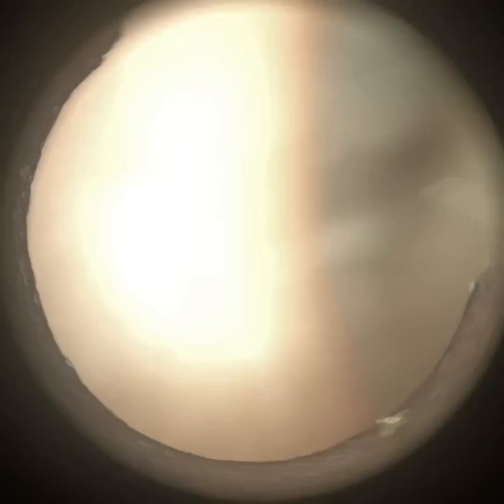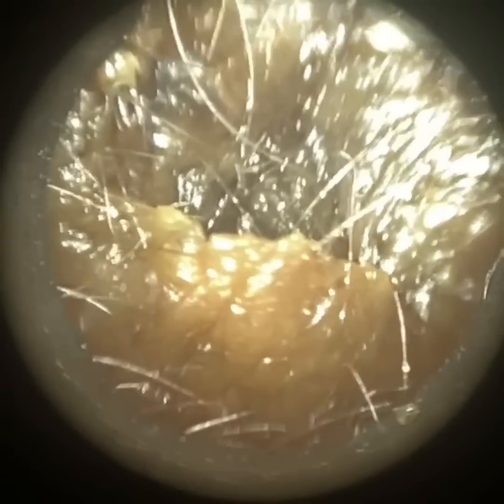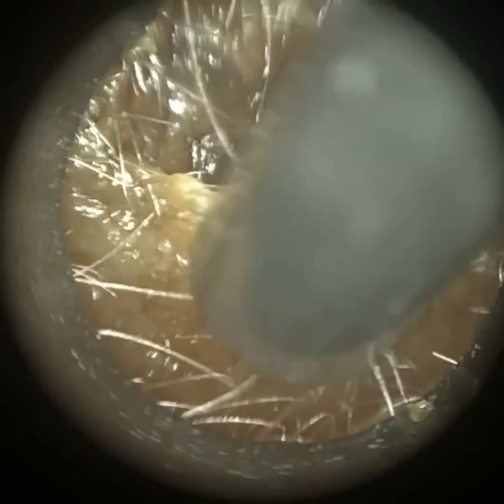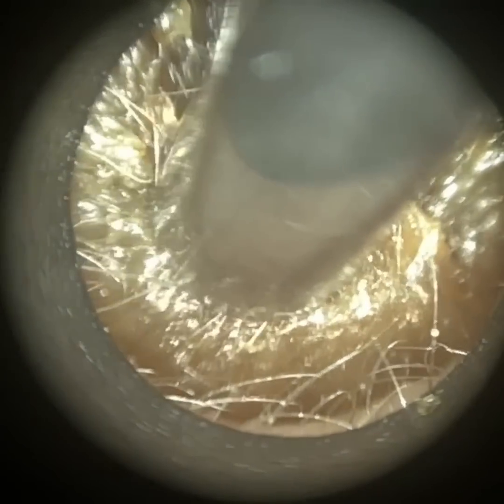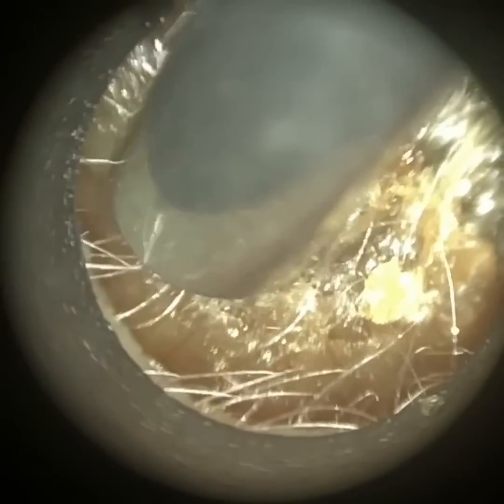And here we have a patient who attended with plugs of dead skin and ribbons of dead skin that I peeled away from their ear canal. And we are treating this patient right here. This occlusion extends right from the entrance where we are now, all the way to the eardrum. And they do have a slightly inclined ear canal.